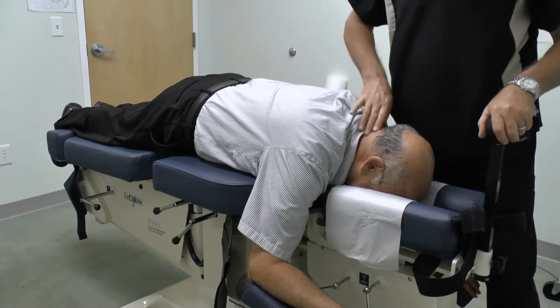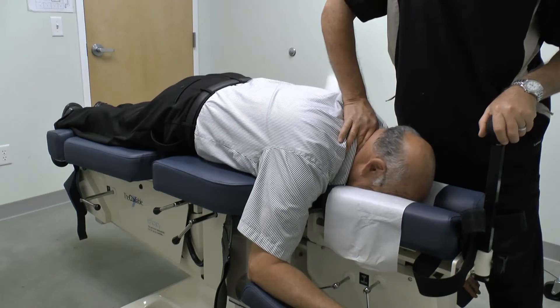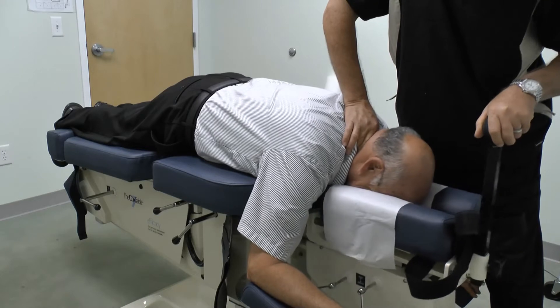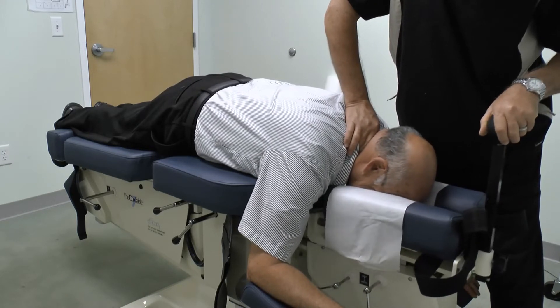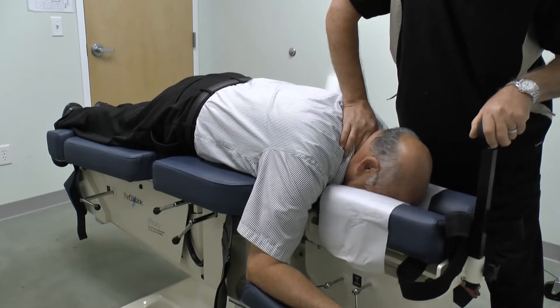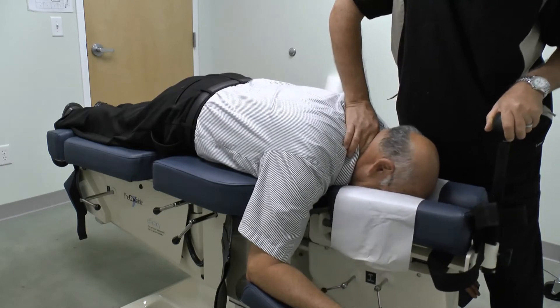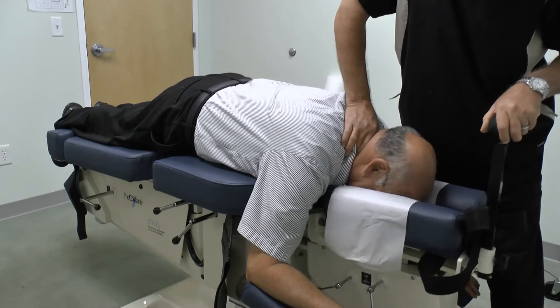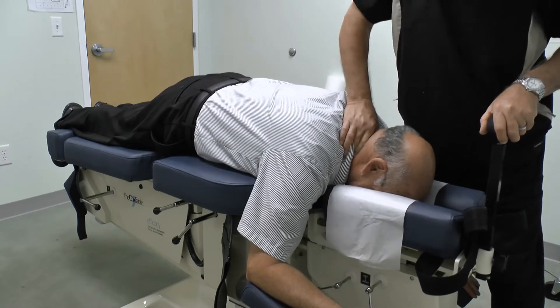Next we will do lateral flexion under long y-axis — ten repetitions to the right, ten repetitions to the left. Back to the center.